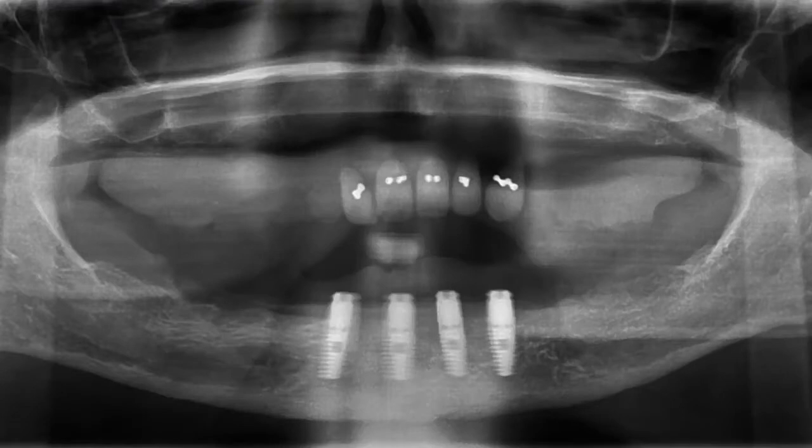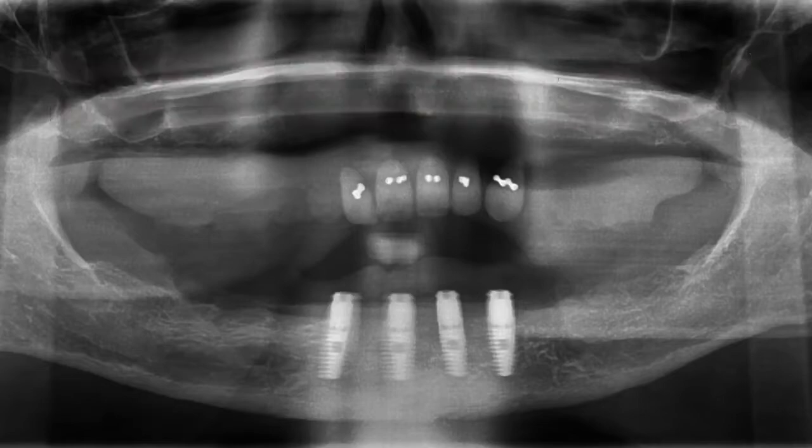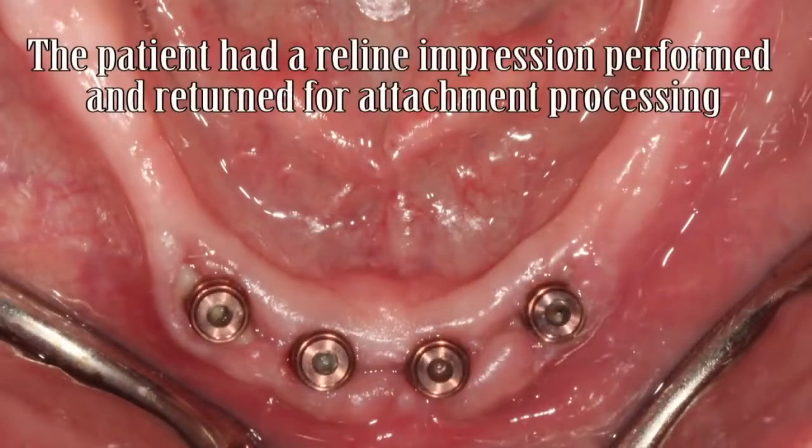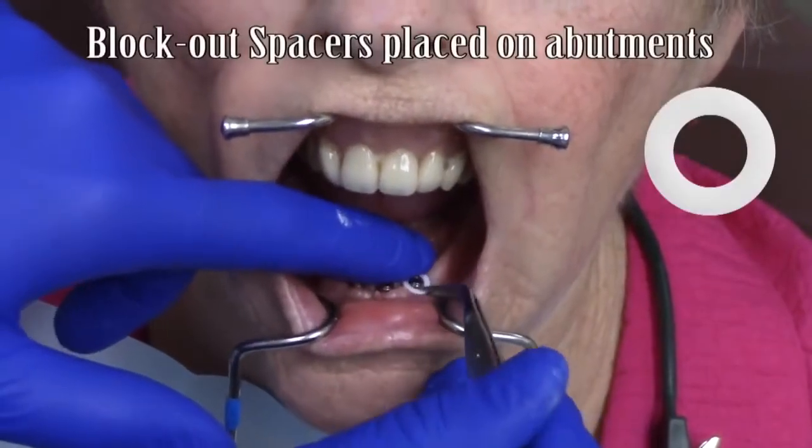Hello, this is Dr. Michael Scheer with LearnLocator, a free resource on how to treatment plan, utilize, and maintain Locator and Locator RTX attachments for overdentures. This video is a clinical technique demonstration illustrating denture attachment procedures employed with Locator RTX.